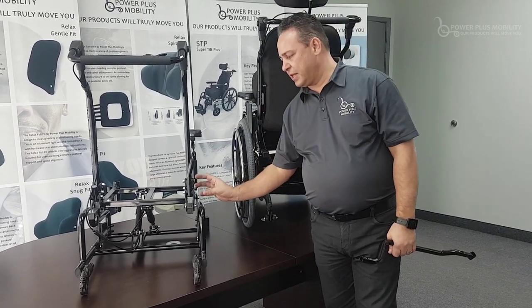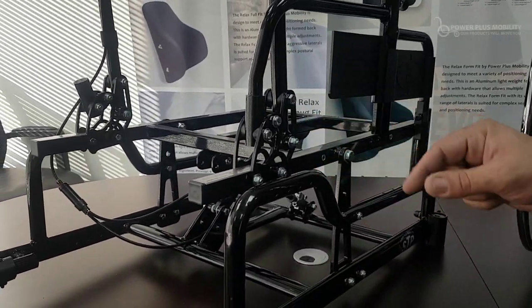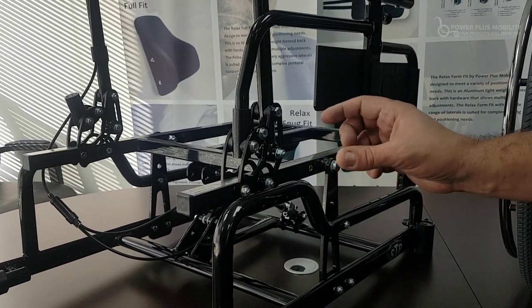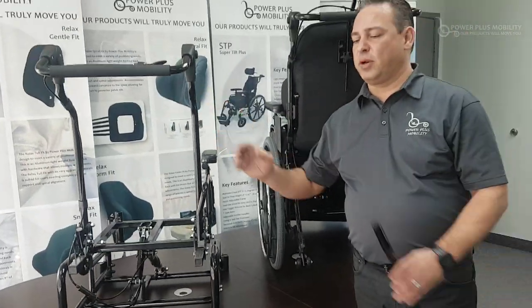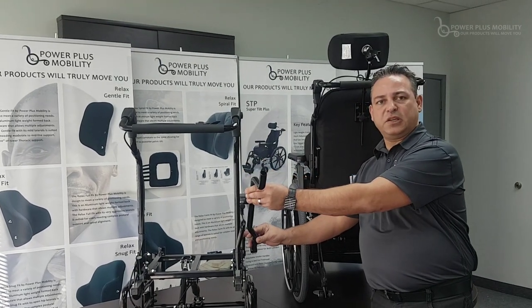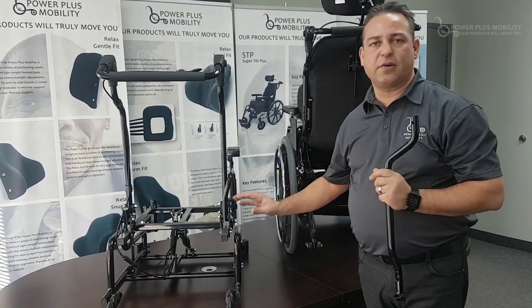Another option is this bracket assembly that you see down below here. A lot of people ask what all of that is — this is an angle adjustable back cane. By having this hardware, which is universal to all of our chairs — our manual chairs and tilt chairs — we're able to take the degree of back cane and bend it back 5, 10, or 15 degrees to open up the hip angle and accommodate for your seating and positioning needs. This is a standard option.